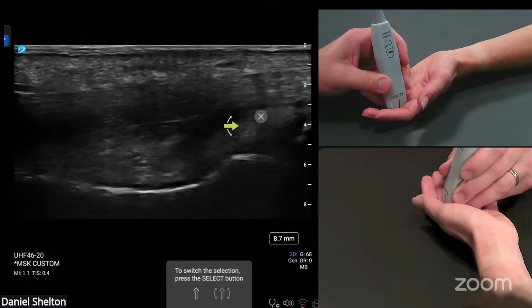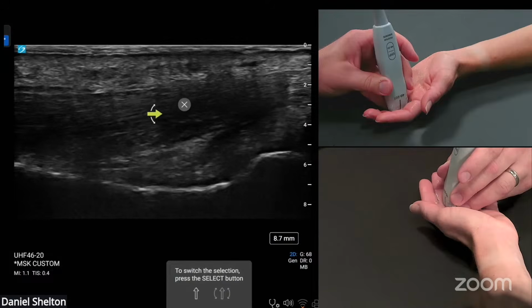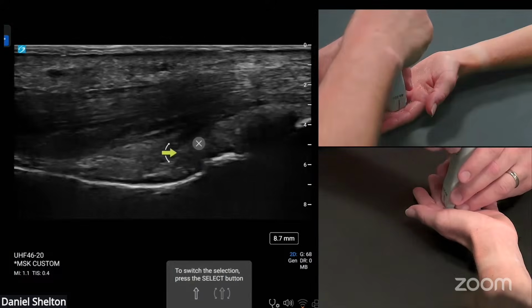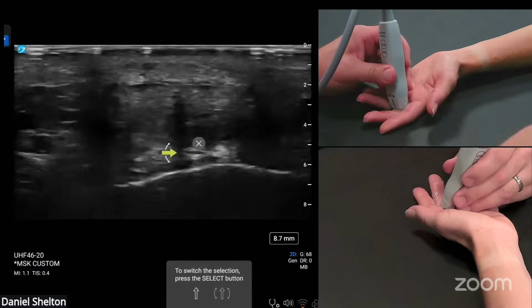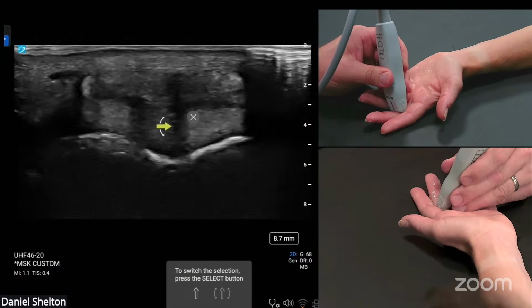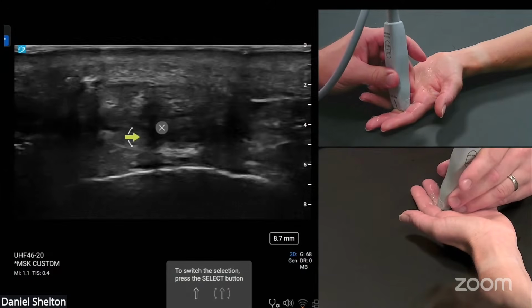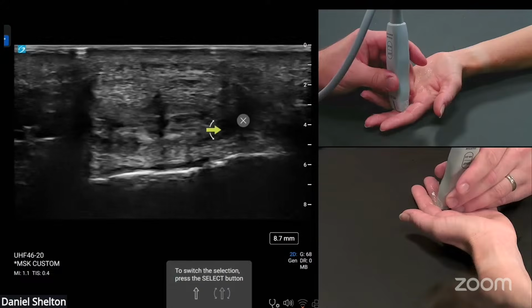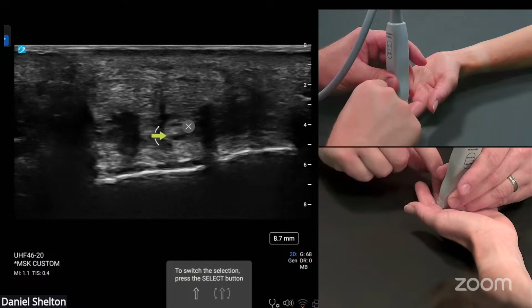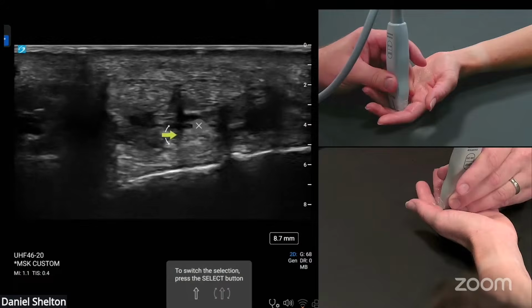attaching to palmar plate. And then that Camper's chiasma that we were talking about is the rest of the connective tissue above that and below the flexor tendons, which acts like a hammock, bridging the gap between superficialis and profundus right here. So cross-sectionally, here's the PIP cartilage, volar plate, palmar plate. I'm gonna go proximal to that. We can see the shadows of the check reins. And then between the check reins, we have this hammock shape right here. That's not part of the flexor tendons. Doesn't move with the flexor tendon. It's a hammock. I think of Camper's chiasma as like a camping hammock.